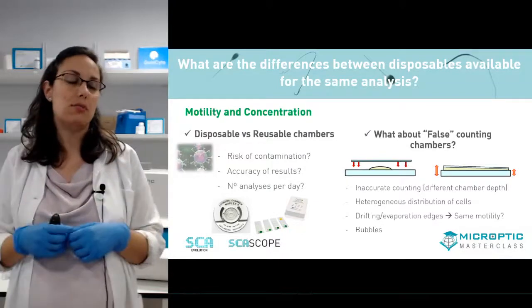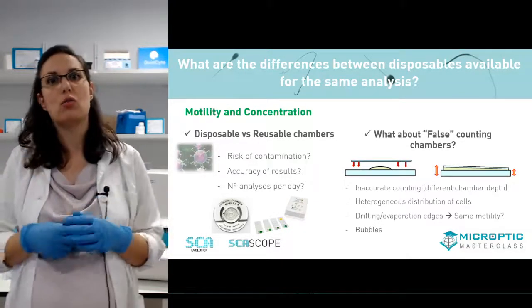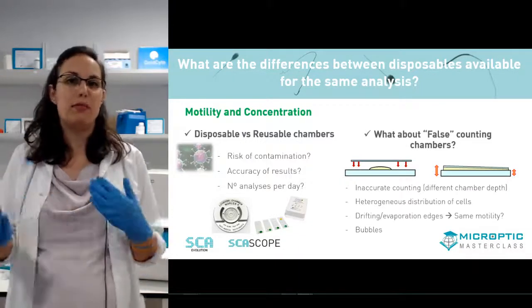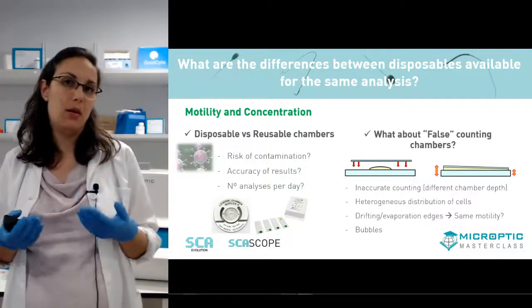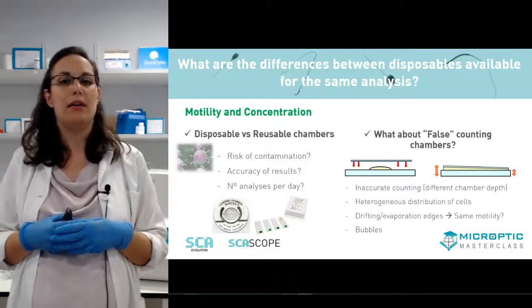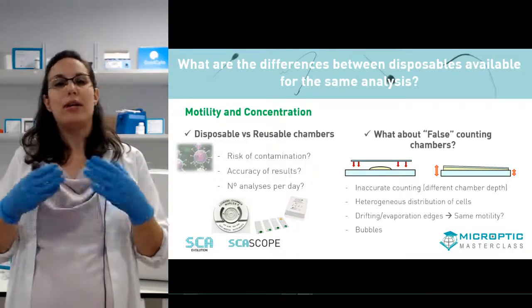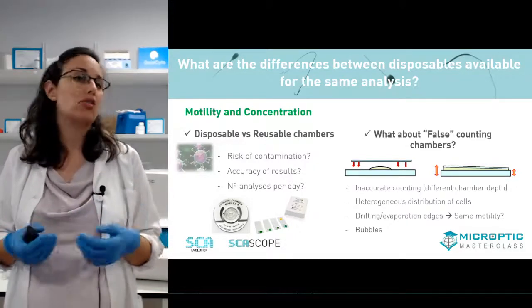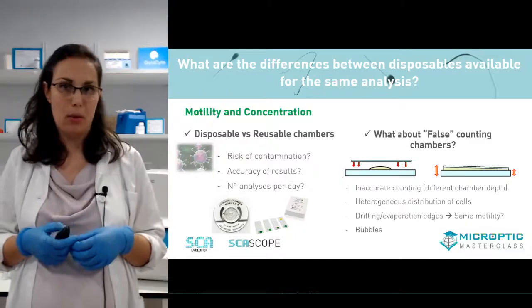Also, it's very common to find so many bubbles that could disturb your results. Therefore, despite being used by so many laboratories, none of the accredited laboratories are using this type of chamber because they are not accurate at all.